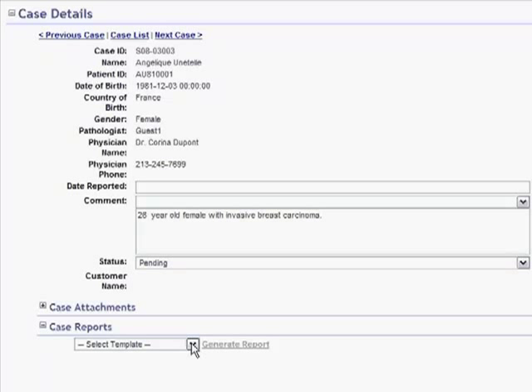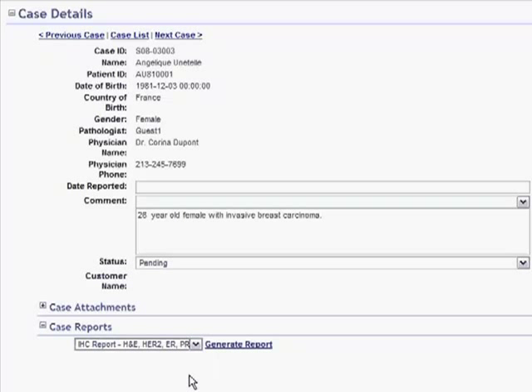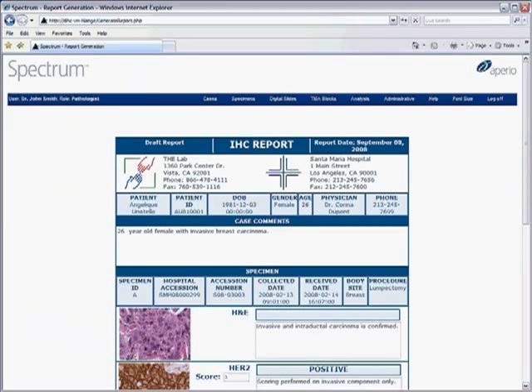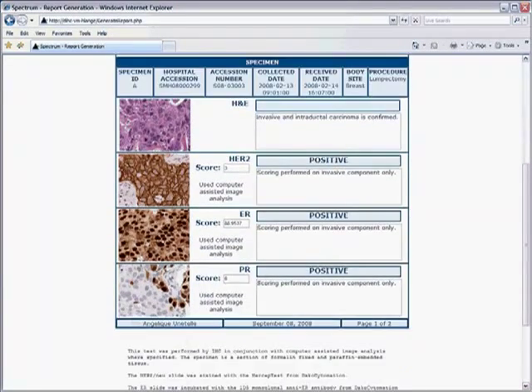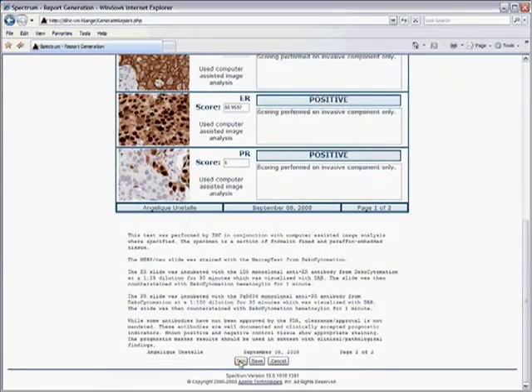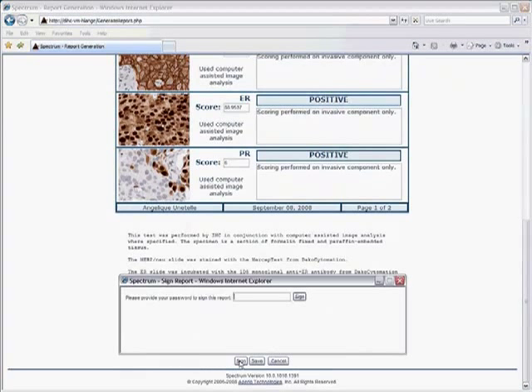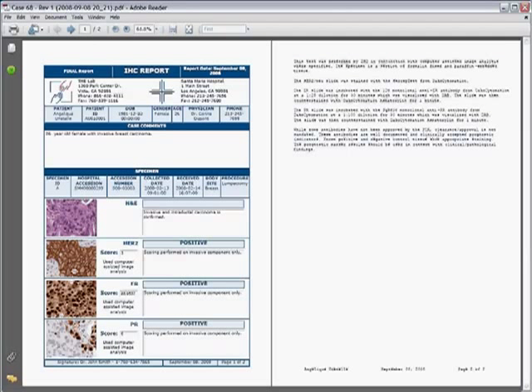Automatically create error-free professional reports with embedded images from the slides. Review the report and sign it with an electronic signature. Final reports are stored securely as uneditable PDF files.